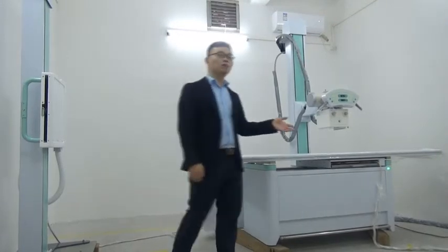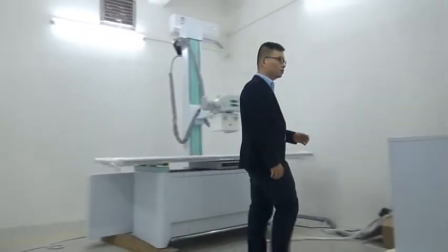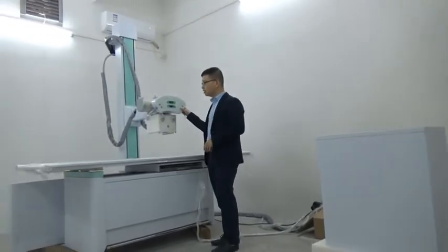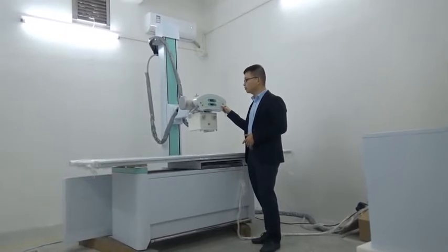First, I would like to introduce the X-ray generator part. We adopt our own high voltage generator. It is 50 kW, 30 kHz, and 150 kV. For the X-ray tube, we use Toshiba to ensure the quality of the X-ray generator.